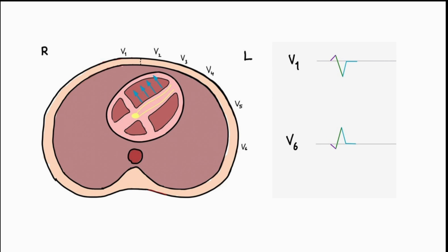What happens next? Well, we get right ventricular depolarization from the right bundle, slightly after, but it's all nice and narrow. It's all happening really quickly. Okay, so this is our normal QRS. But we'd be out of the job if everyone was always normal. So what happens in conduction defects?